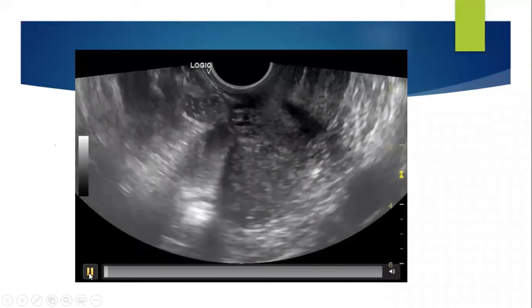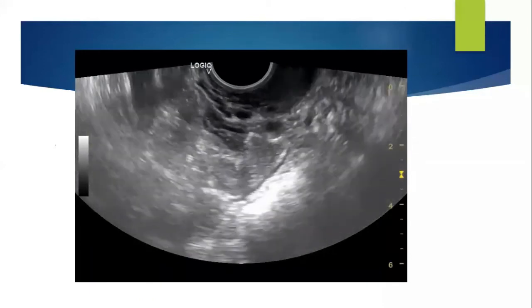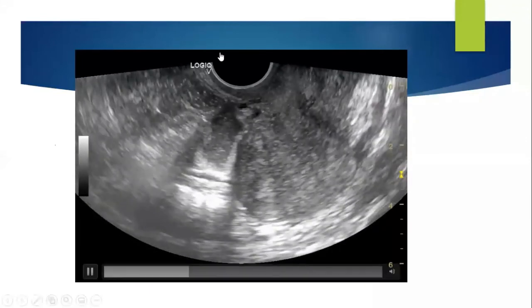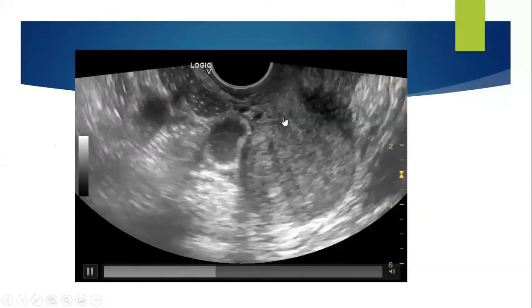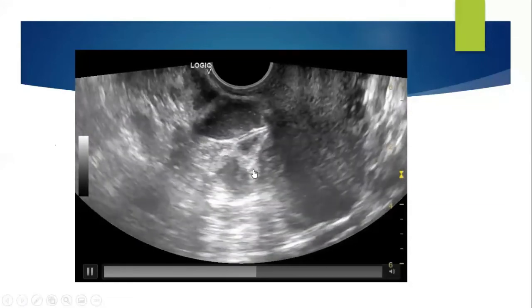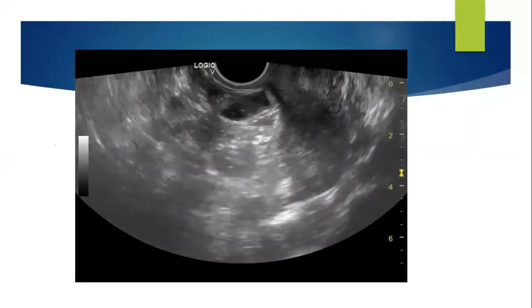And rarely you see this kind of uterine position also. See again, I'm trying to show you how the ovaries and the uterus in this axial position were seen. And it was difficult to see. Can you see the straight line coming from the cervix to the fundus? And then with the help of this mid-sagittal section only, I'm trying to identify where the ovaries are. And I was focusing on the right ovary. Again, see how I'm looking for the right ovary.